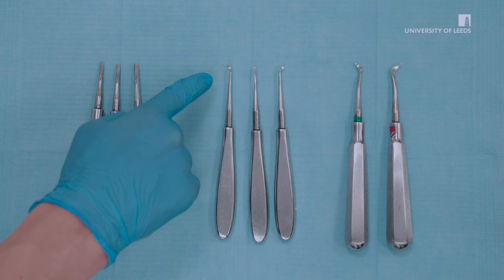There are three main groups of elevators: the Cooplands, Warwick James, and Criers.